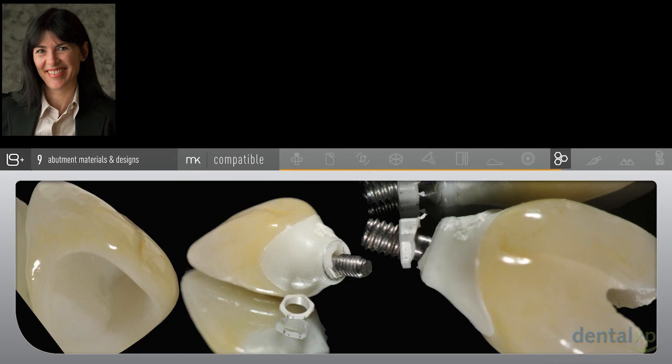And where are abutments fracturing now, years later? So usually we're at about the 2-year post-load is where we see the problems occurring. We're starting to see abutment fractures. Now, I also want to tell you that we avoid today by thinking about what's going in the head of our implant. But as careful and as fastidious as we are about the cementation protocol, I put this little arrow there to show you that we thought we got all the cement out. We thought our hygienist was maintaining effectively, but there's still cement.